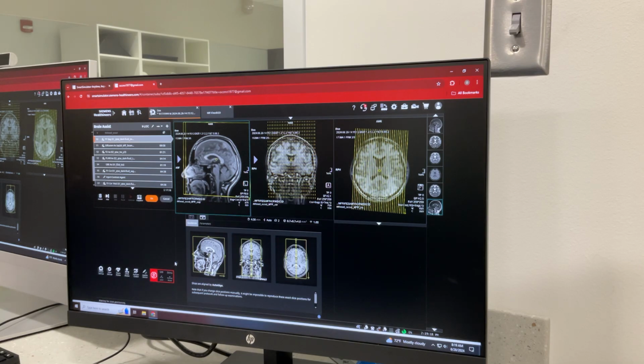But once your patient's in there, it doesn't matter, because we don't necessarily need to open up the scout, since we don't change anything or do anything. That's just a dirty scout that's running to show us some quick anatomy so we can start planning our planes. So that's how you pull your protocol over. Now keep in mind, that's pulling over the whole protocol for the brain with and without, and we're not doing the entire thing, so just make sure that you're going in the proper sequence.